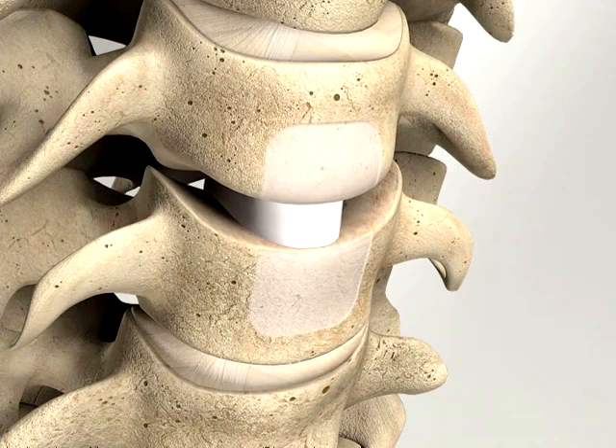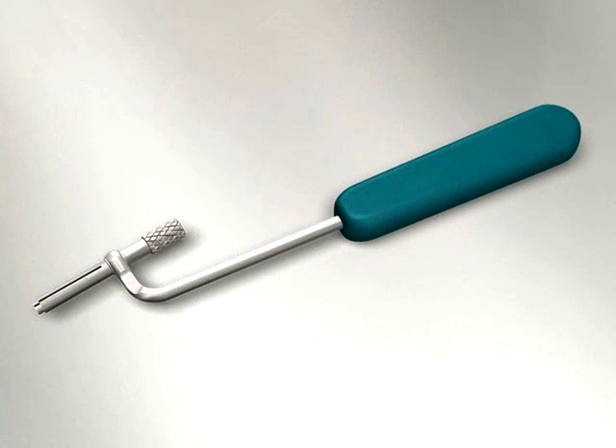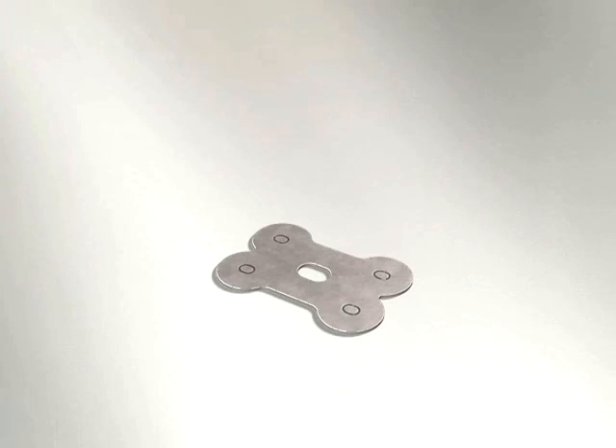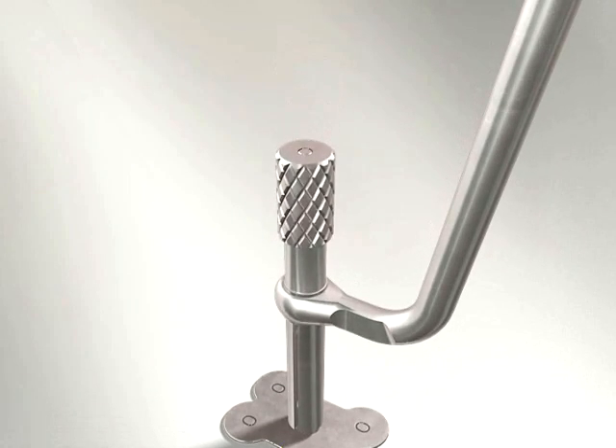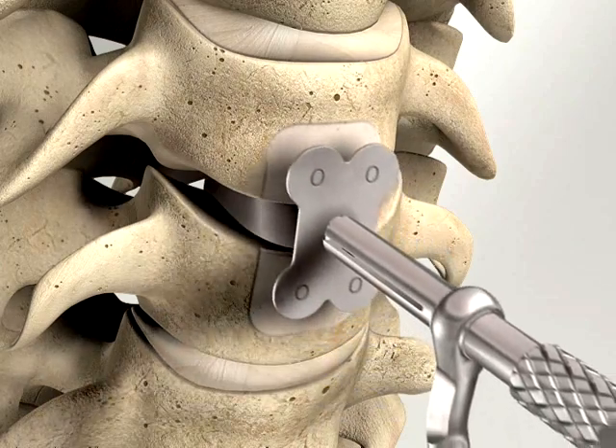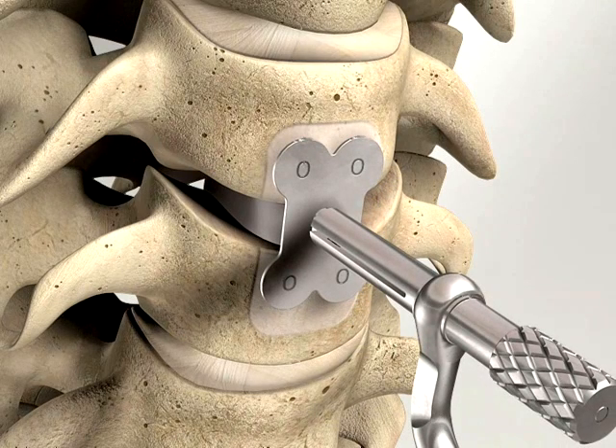Implantation: Use the plate templates mounted on the plate holder to determine the appropriate plate size. Place the suitable size template against the bone at the intended location of the plate to confirm correct plate length and screw hole position relative to the end plates.